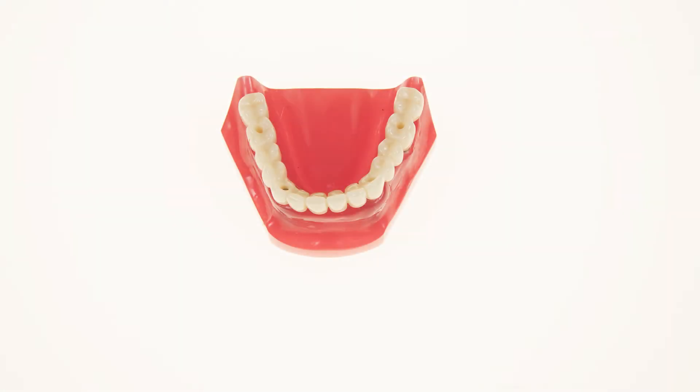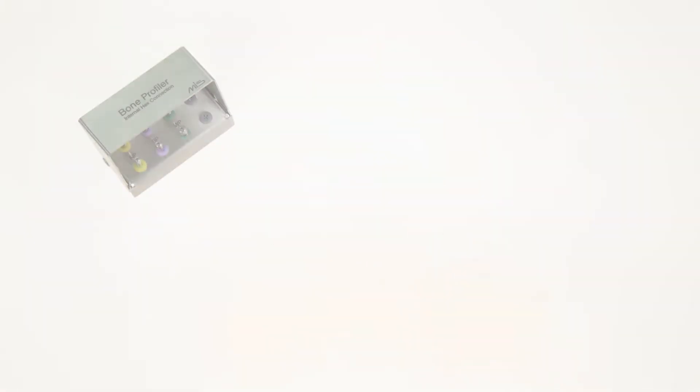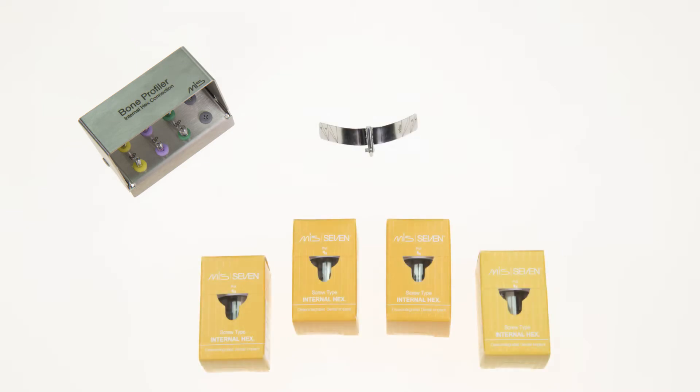Multifix is fixed restoration for atrophic ridges. This means using four implants to restore a full arch with a screw-retained solution over multi-unit abutments. The system includes a bone profiler kit, a guide strip, four MIS implants — two placed in the anterior and two longer implants placed at an angle facing the posterior — and multi-unit abutments.